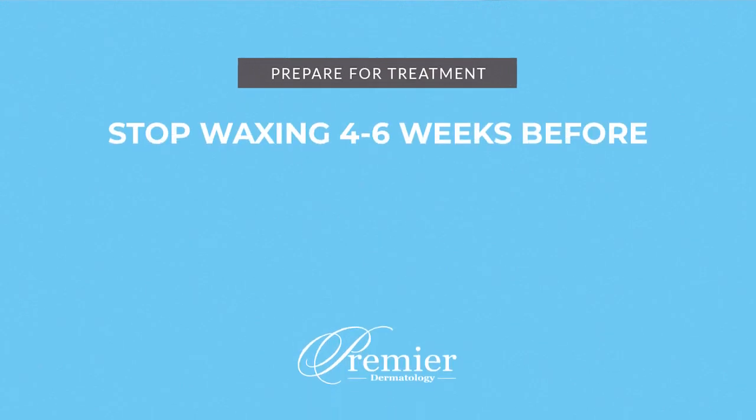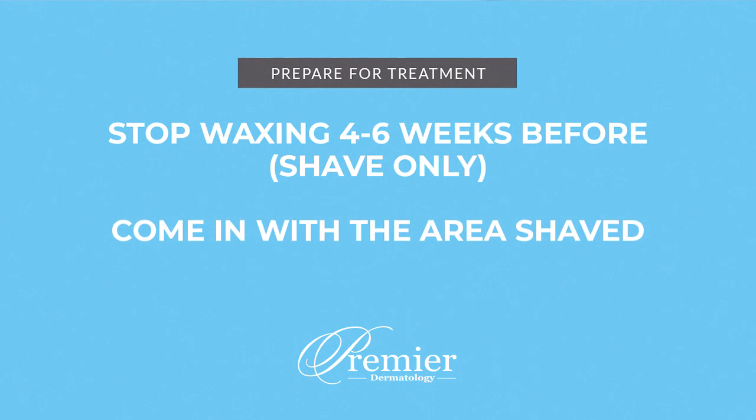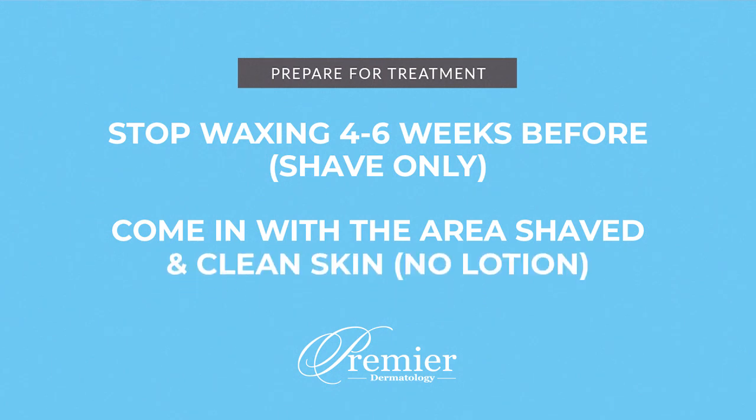All right, so Elena, for laser hair removal, what do you tell patients beforehand? How do they need to prepare so that they get the best treatment? If you're waxing, to stop waxing 4 to 6 weeks before treatment. When you start these treatments, we want you to just shave from now on, and also to come in with your legs or the area shaved. And is it better if they come in without lotion and things like that for the day of treatment? Correct. Just clean skin is what we need.